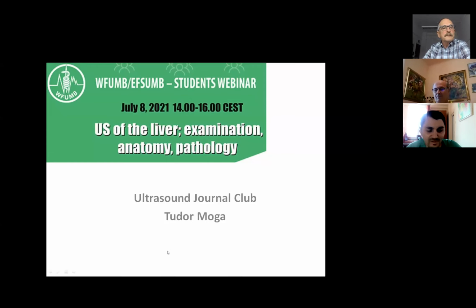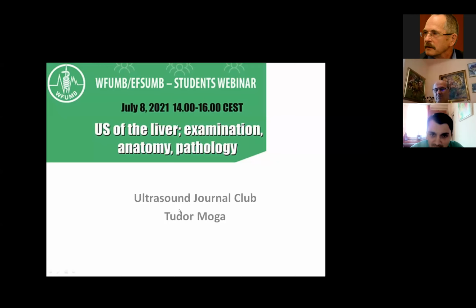I'm quite happy to be part of this team. And I will present you the Ultrasound Journal Club. I have prepared two simple papers because the majority of the participants are students, so it's better to establish the simple things and what we can do with a simple basic ultrasound device.